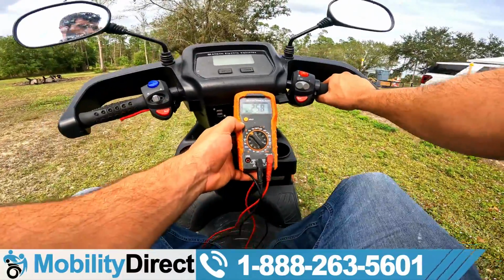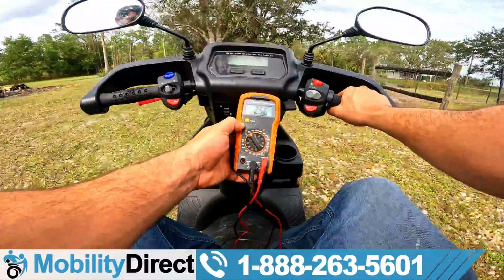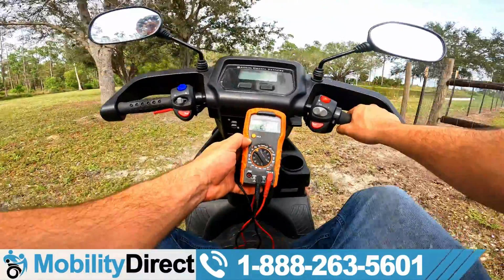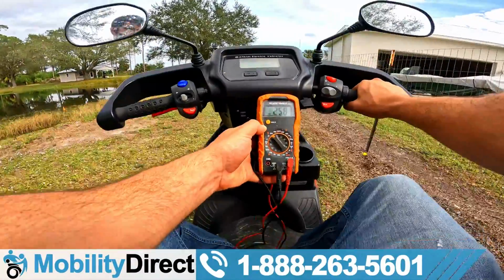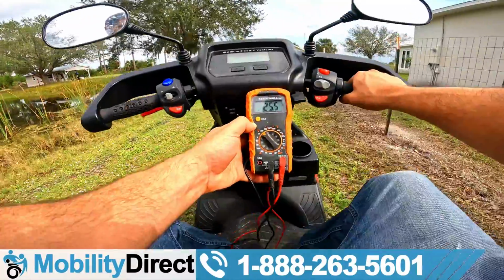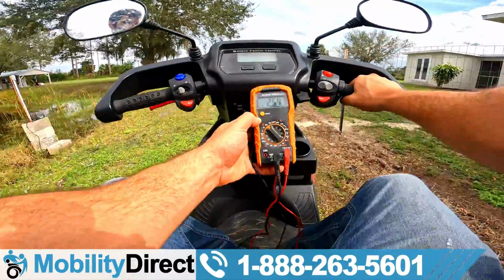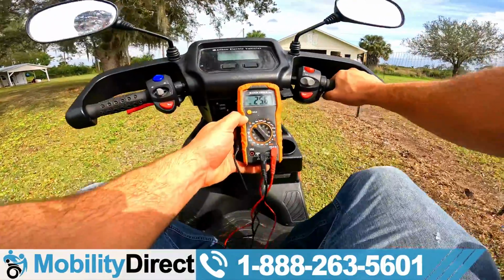Now, if I start going up a hill, it could potentially really lower the voltage. So I'm gonna keep going for a little bit and go over some cobblestone, go over some rough terrain, turn the speed up a little bit and see what happens. I want to see if it gets down to 24 and then shuts off. So far, so good. So it might just be a loose connection on the battery terminal. That's another reason why we would get it to randomly shut off.